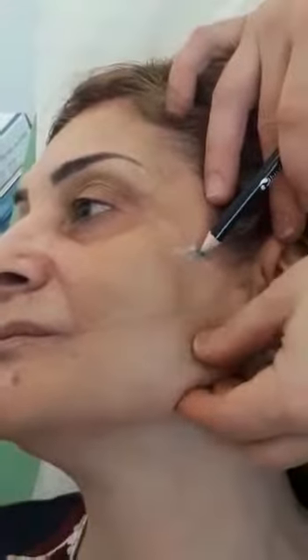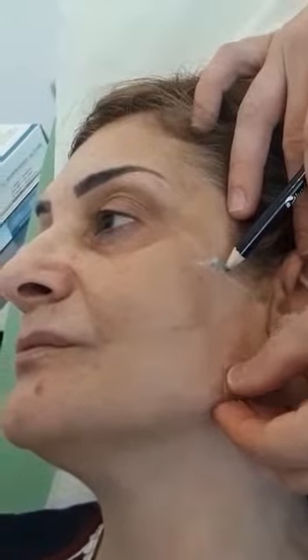There is some patient who has this part very ptotic, and you can sometimes notice that. It's not about jowl, this is just about jawline, so you can also insert the threads here just in order to work on this part.